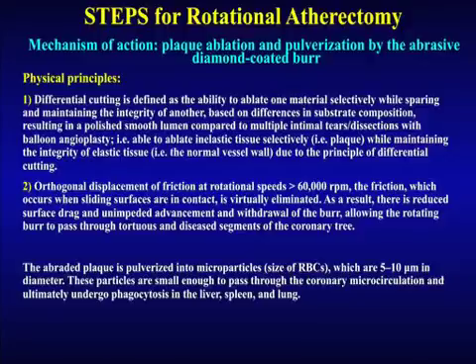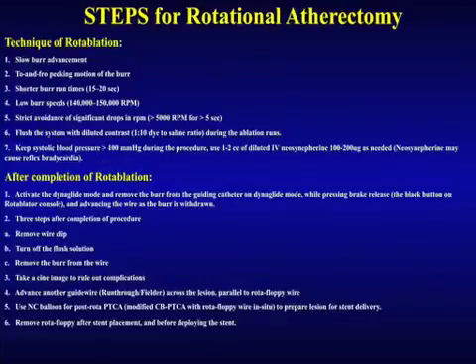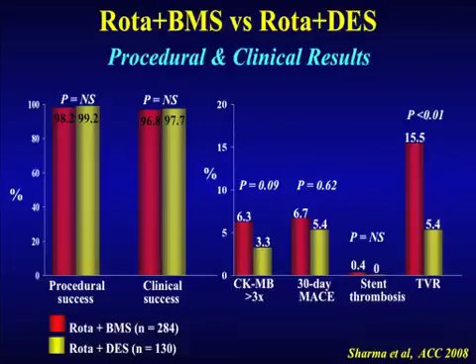What we also have done for the audience is the various steps of rotational atherectomy in terms of physical principle, indications, and steps for the operator, and the techniques of rotational atherectomy in these 4 slides, which you can go over later on. The purpose is to go through step by step, so that the whole symposium live series will be focusing on the steps of the technique. Many of the steps we will just put on the website, so that the audience can come back and later download as well as go through them.